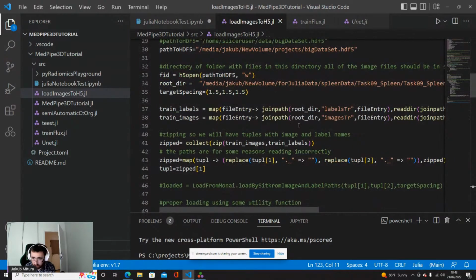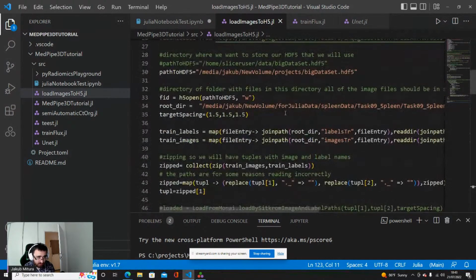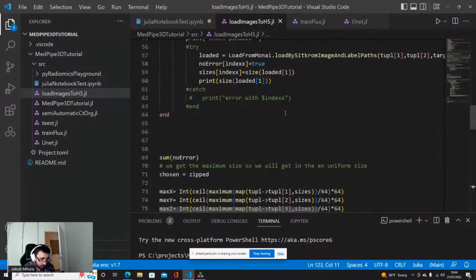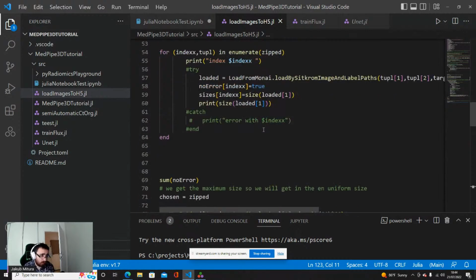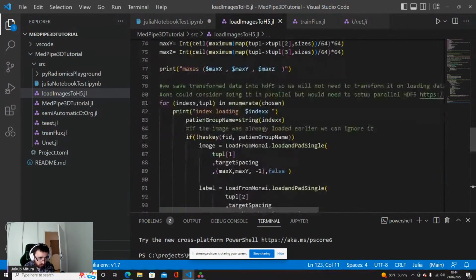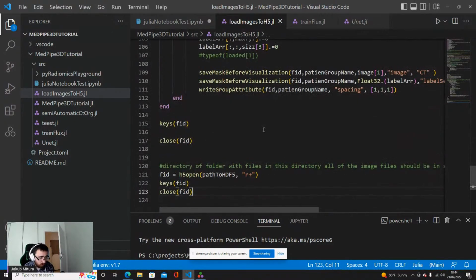So this is the first thing that should be done. Yes, these augmentations. The data should be analyzed in 3D, not in 2D, as I did. I would choose some different metric, or at least choose different metrics and try different metrics out in the hyperparameter tuning. The hyperparameter tuning here should be performed by trying different architectures and so on. So basically there are hundreds of possibilities that we can do here.